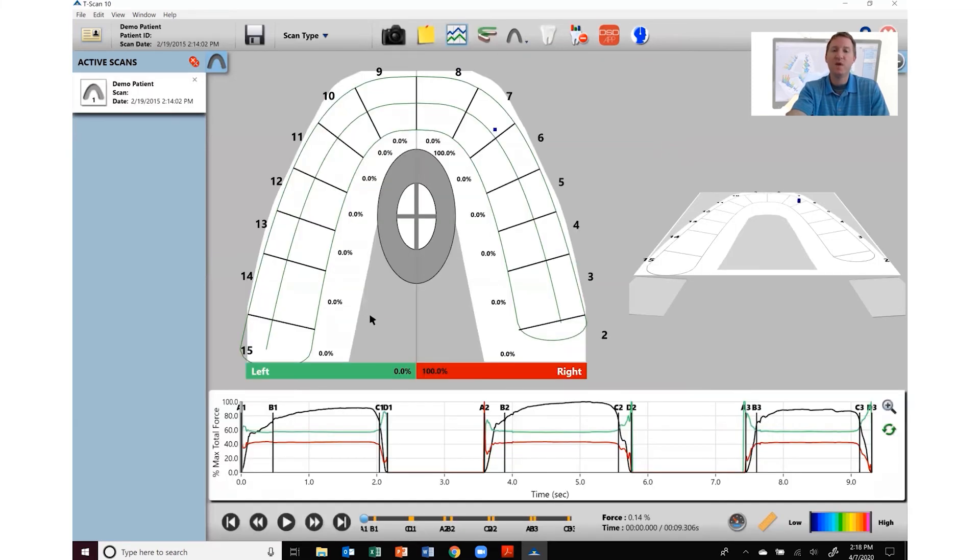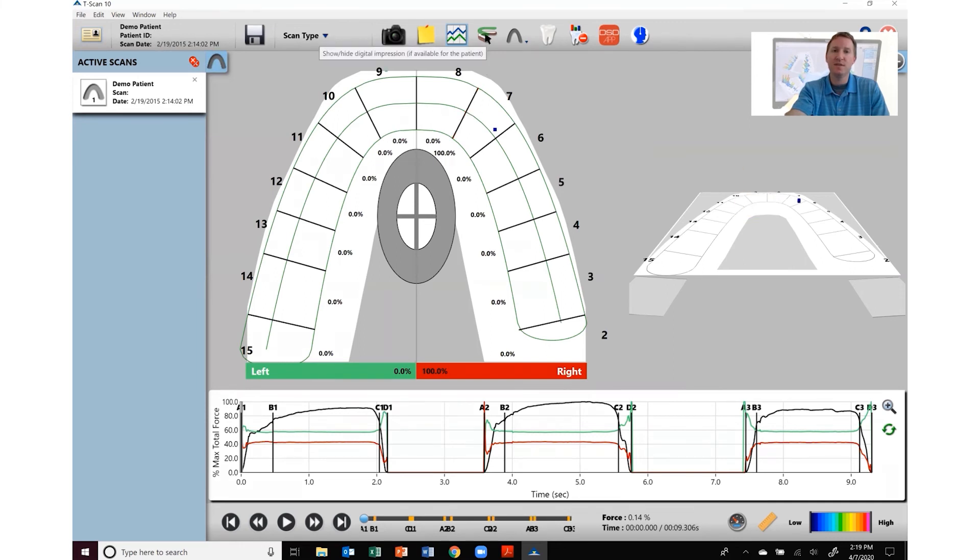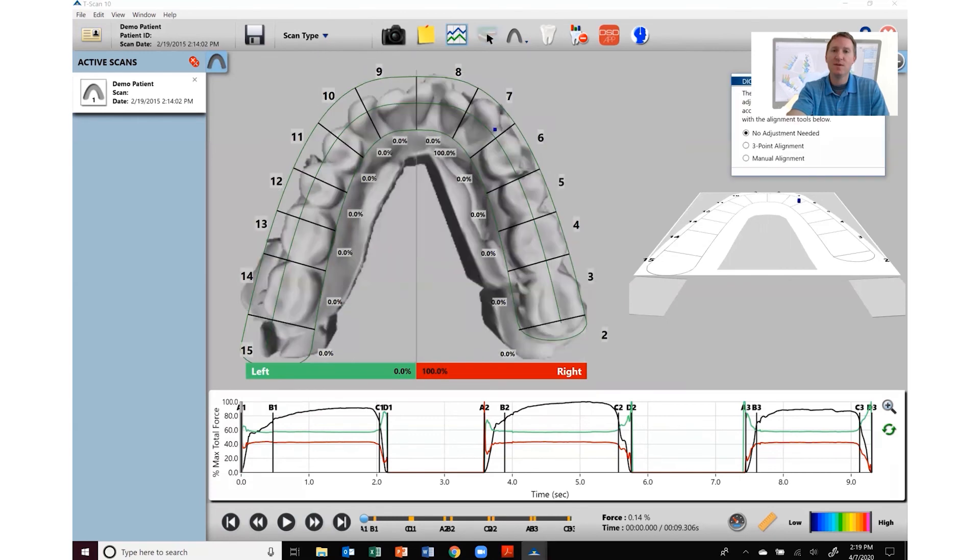The way you bring your digital impression overlays into your Tscan software is you click on the digital impression tab up here and then that will bring in your digital impression into your Tscan system.